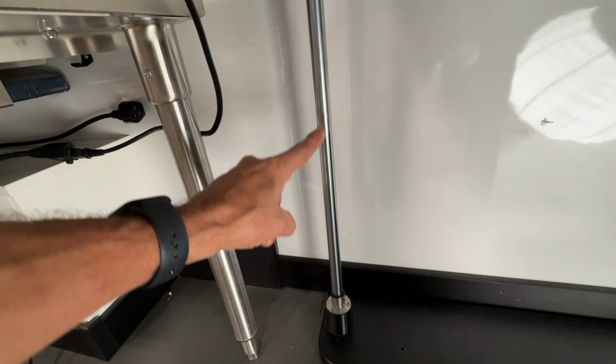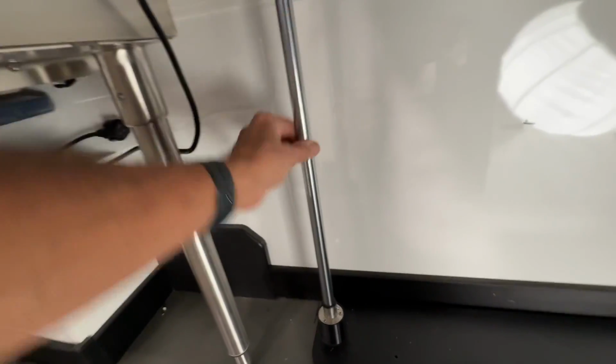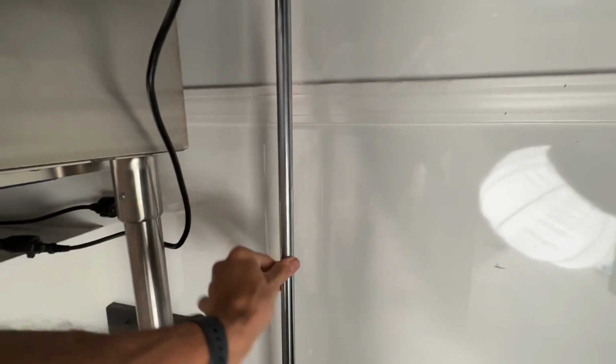Raise the table to number 4, and you do not need to put any grease on this lower portion of the rail because the bearings are only moving in this upper portion of the rail. Smear some of this silicone grease, a small amount. It doesn't take much, so a little bit goes a long way, because if you see it gobbed on there, it's too much. We want a very, very thin coating of it on this upper portion of the rail.